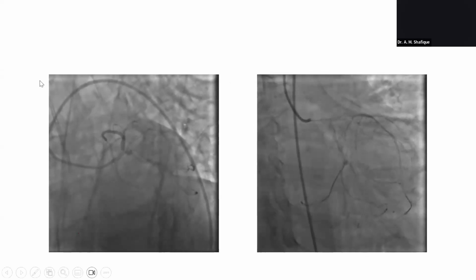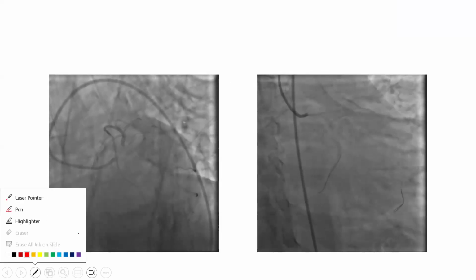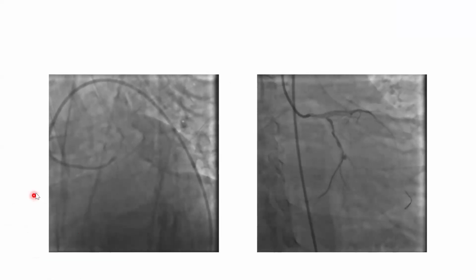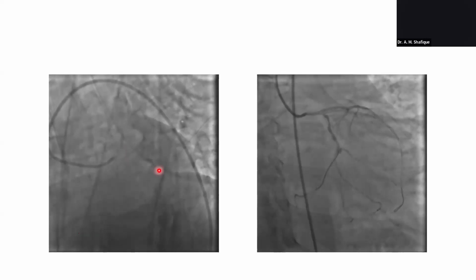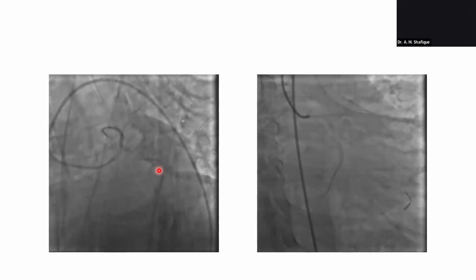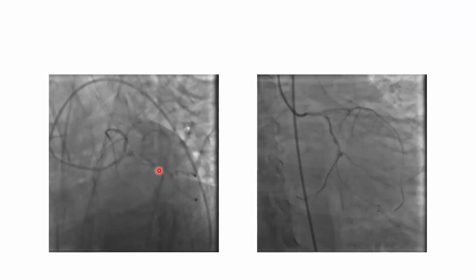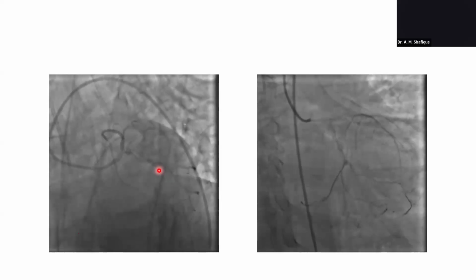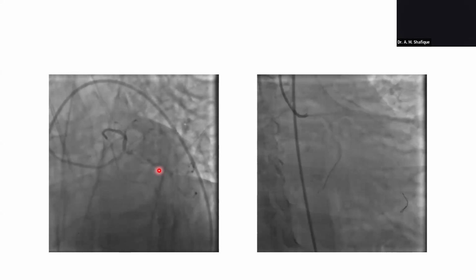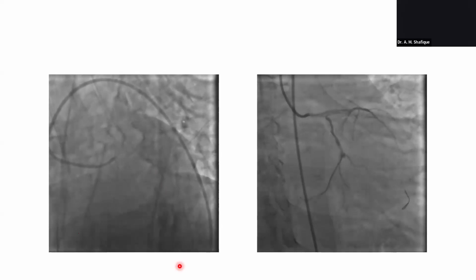You can see the thrombus here at the bifurcation. Here at the engagement there seems to be ostial disease. And the left main is severely diseased, from the ostium to the distal bifurcation, and there is a thrombus at the distal bifurcation. There is no regurgitation of contrast while injecting. Severely, totally diseased left main.